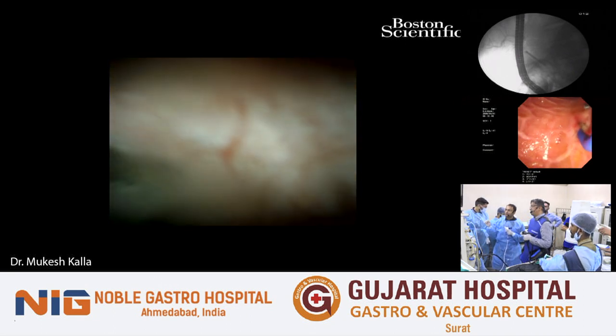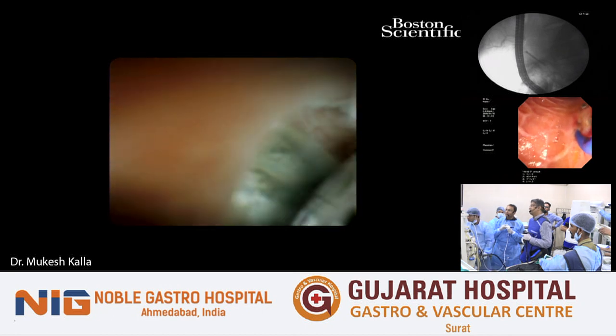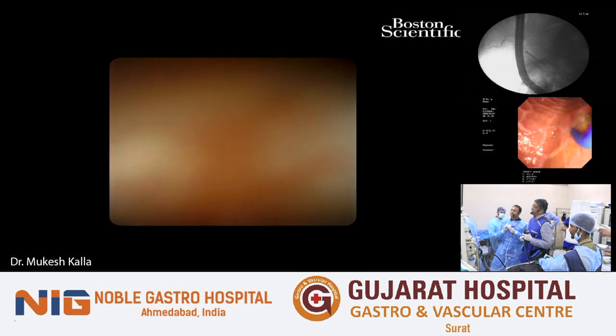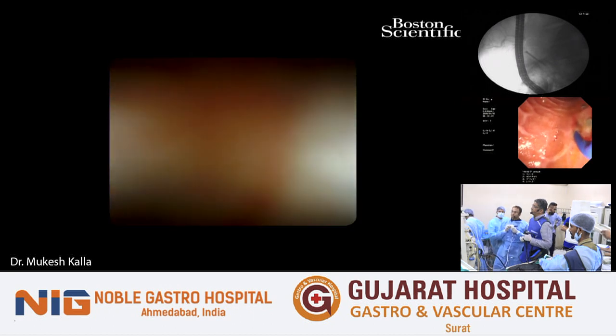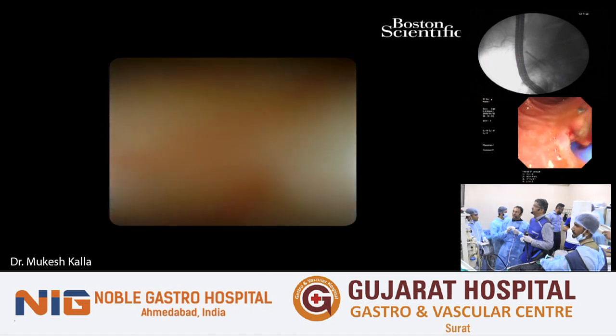Difficult. Yes. Hold it. Yes. Give it to me. And another trick is that if I can go beyond the stone, I will keep flushing and I will get this stone towards the common bile duct.